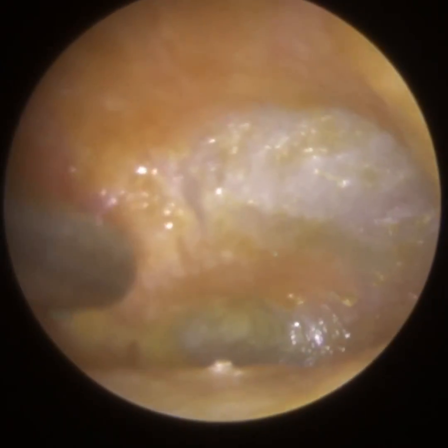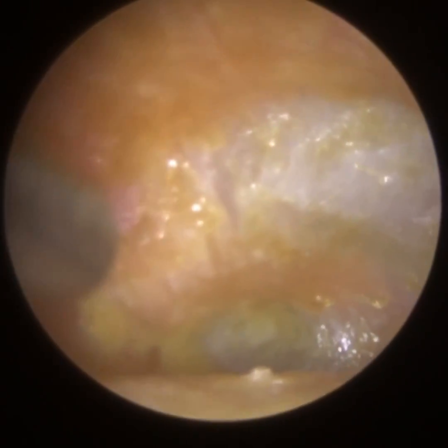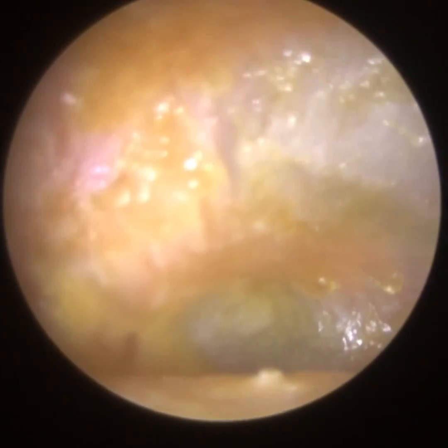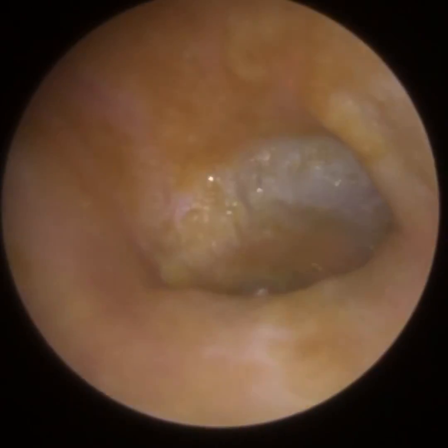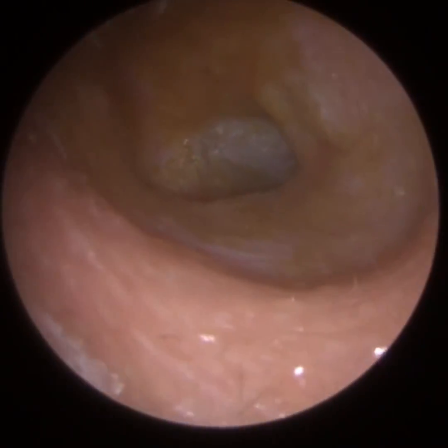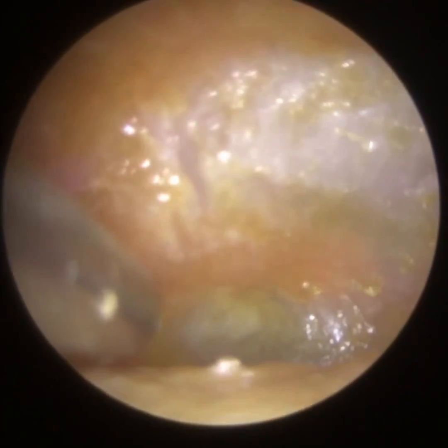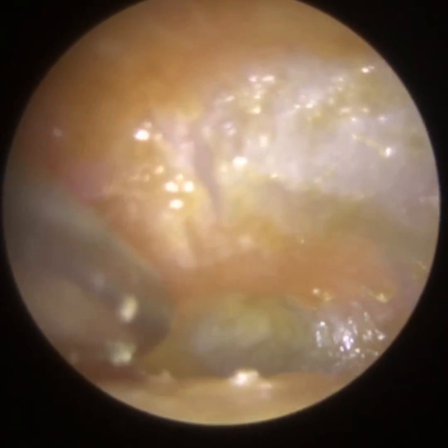I was always a bit skeptical. I said, well, there's no occlusion, there's no blockage, it's just dry skin of the ear canal now. Is it best treating with medication, which is the norm? Or is there any point me trying to suction it, because we could sometimes make things worse if we cut into the ear canal wall, because we are moving stuff off the ear canal wall, especially the bony part. We're now exposing the canal wall to infection because it's obviously exposed, it's cut, it's open.